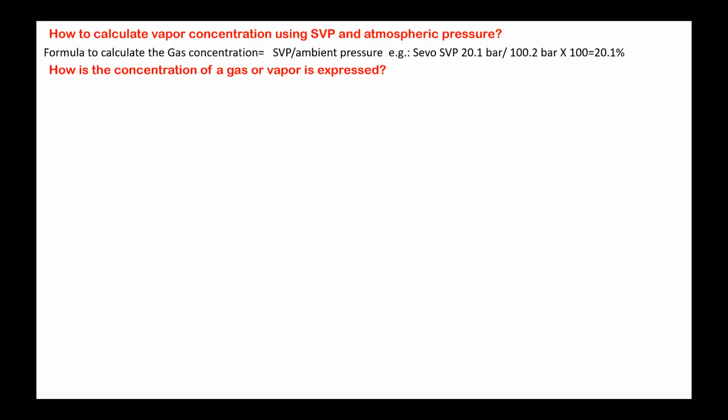8%. It is the safe limit. Okay. So if you want to deliver 8% only maximum, you have to use a vaporizer. You cannot use sevoflurane, isoflurane, or desflurane like open drop, what we used in the olden days. Okay. So this is a very important concept that you have to know.